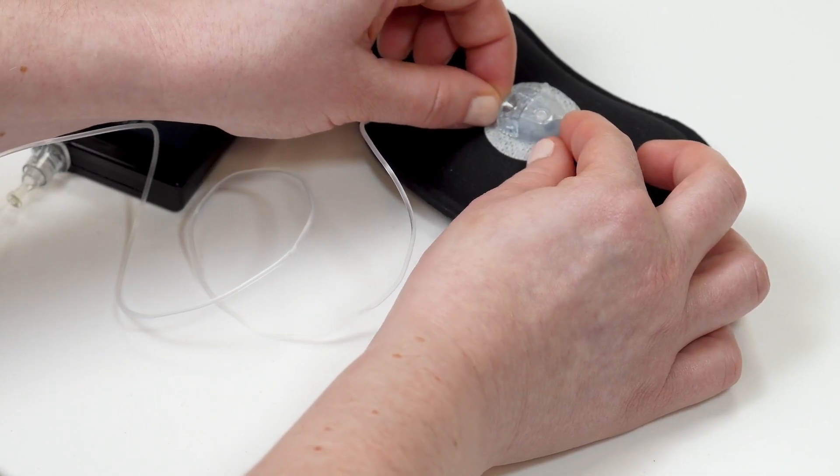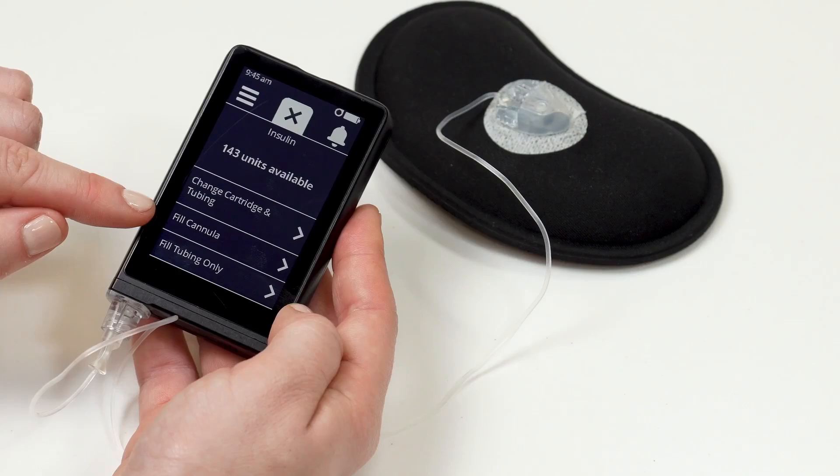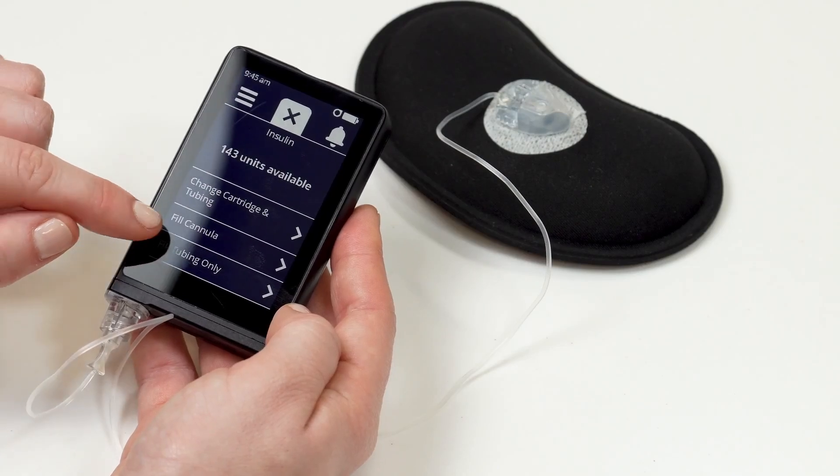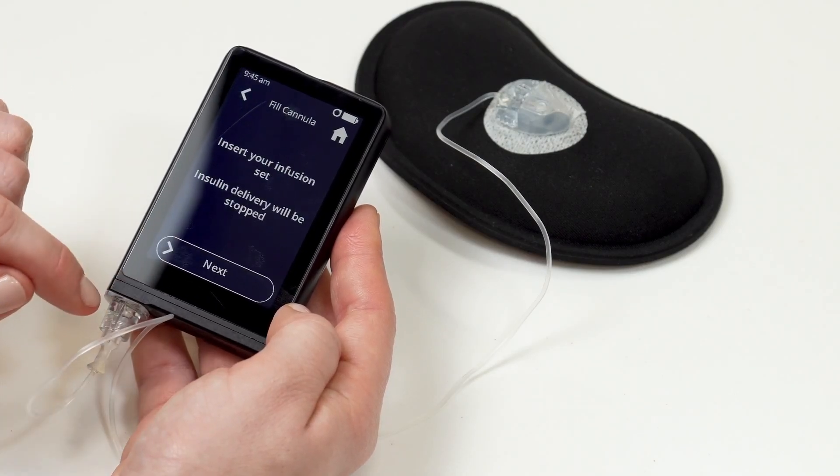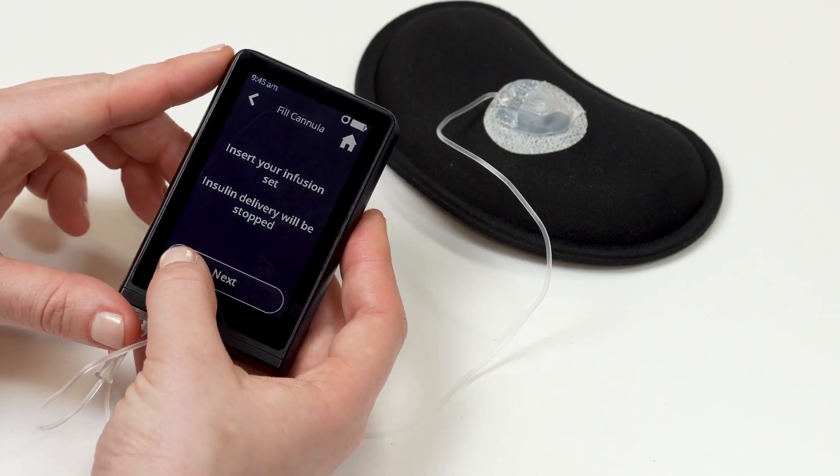Unlock your islet device. Tap the insulin cartridge icon on the home screen of the islet. Tap fill cannula. Swipe next to confirm you have inserted your infusion set.